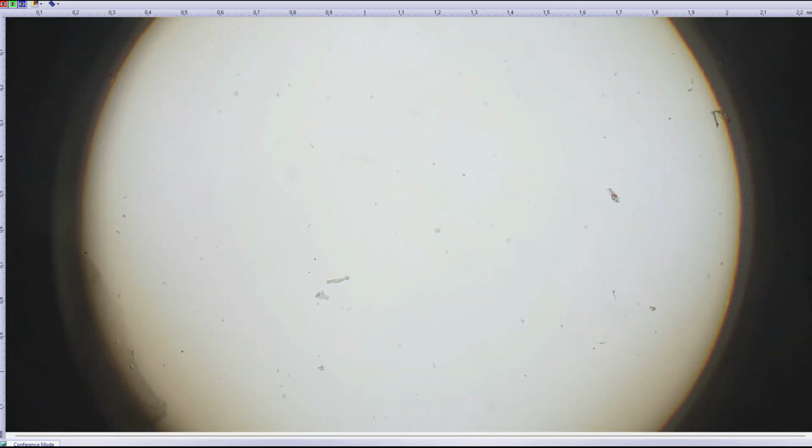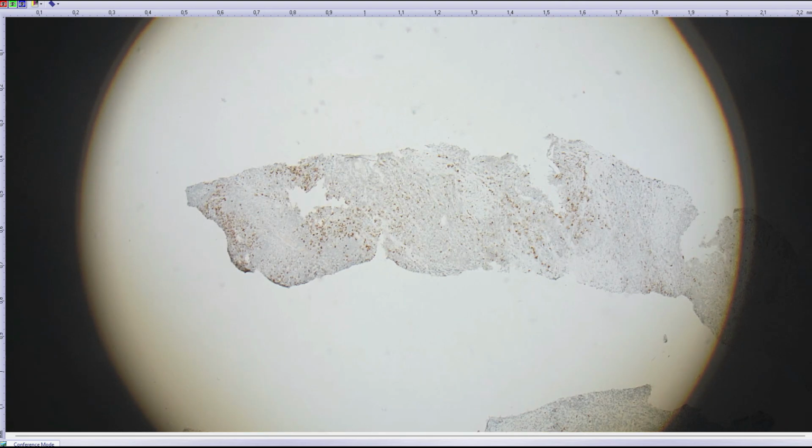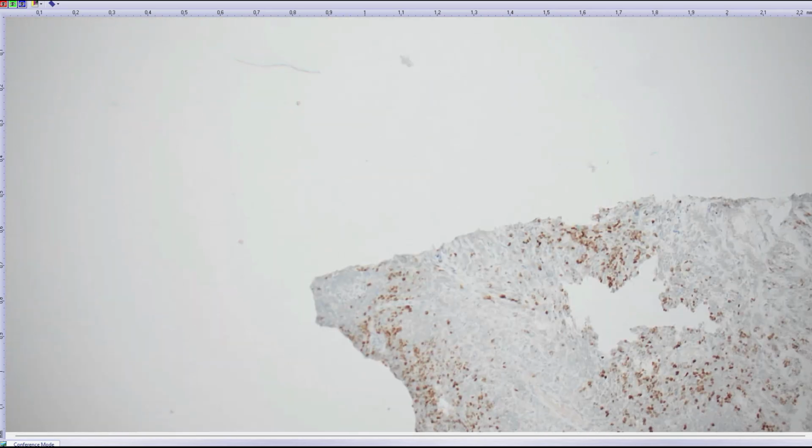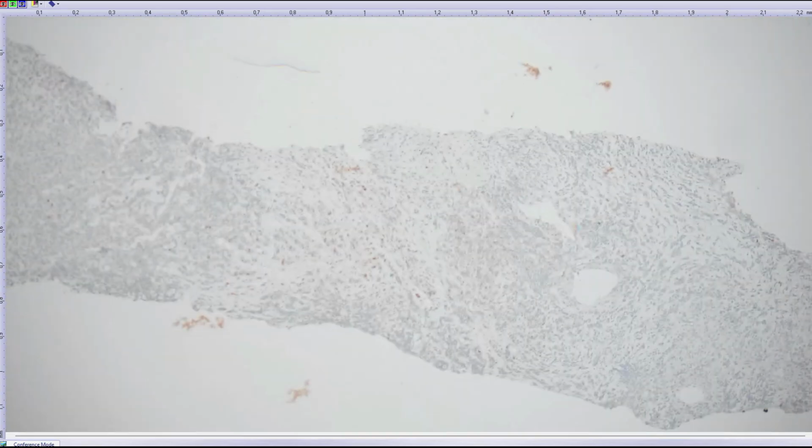So you use a broad panel, some lymphoid markers, some broad spectrum cytokeratins, S100, SOX10, Desmin. This would be, I think, a reasonable panel to start with, and this is SOX10. So pretty nicely positive. S100 was similar. A little faint here, but there is some positivity.